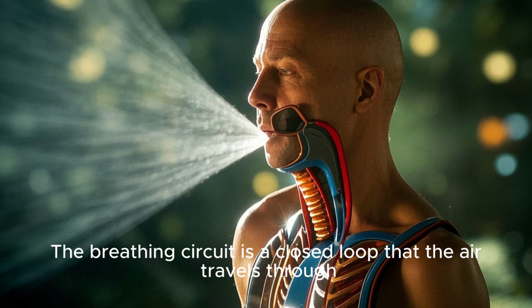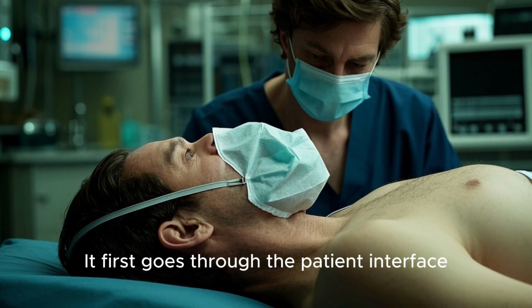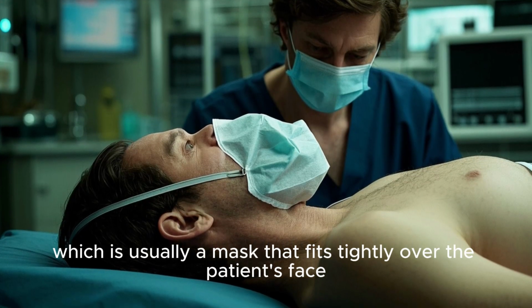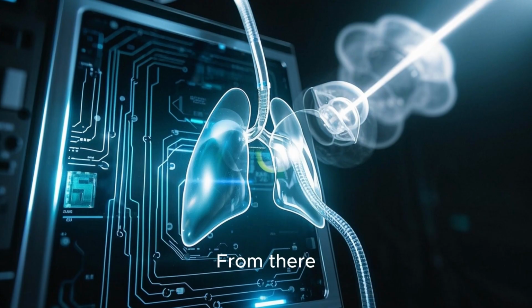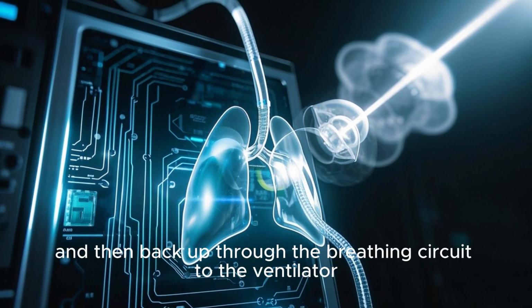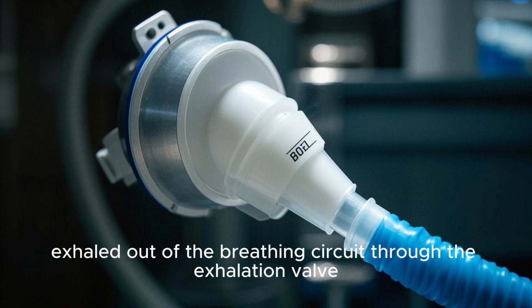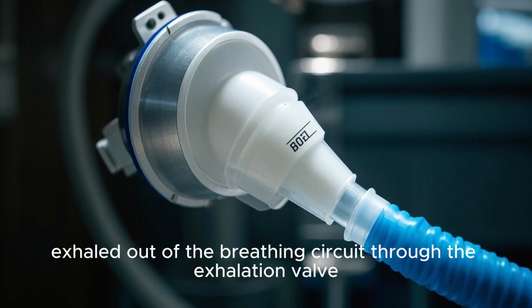The breathing circuit is a closed loop that the air travels through. It first goes through the patient interface, which is usually a mask that fits tightly over the patient's face. From there, the air moves into the lungs, and then back up through the breathing circuit to the ventilator. Any air that the patient doesn't use gets exhaled out of the breathing circuit through the exhalation valve.